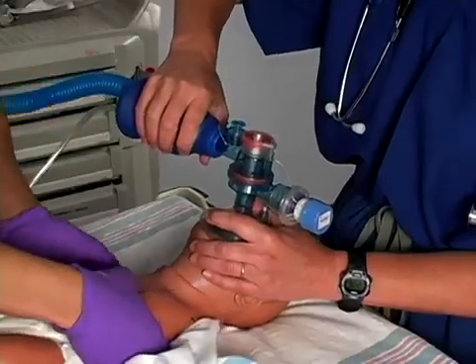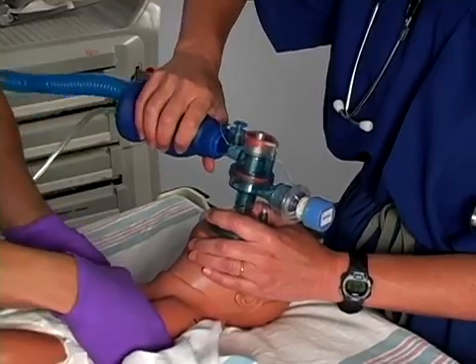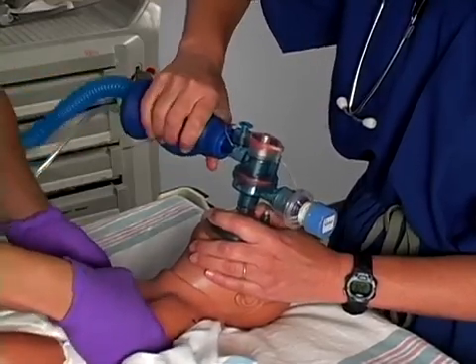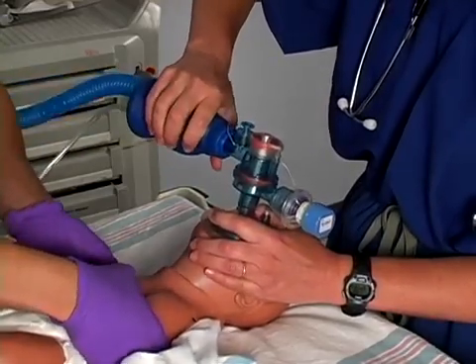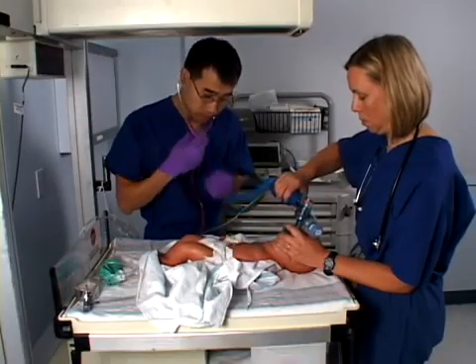1 and 2 and 3 and breathe. 1 and 2 and 3 and breathe. 1 and 2 and 3 and breathe. I'll reassess.